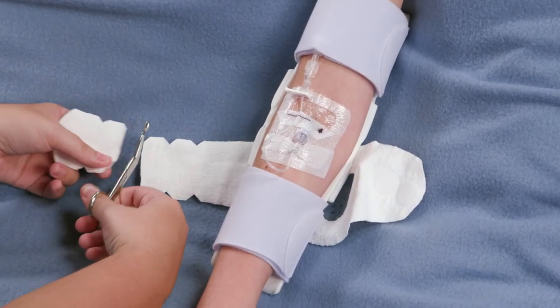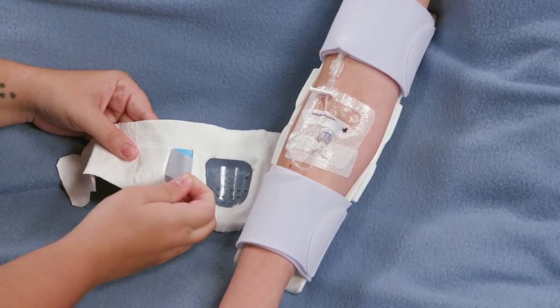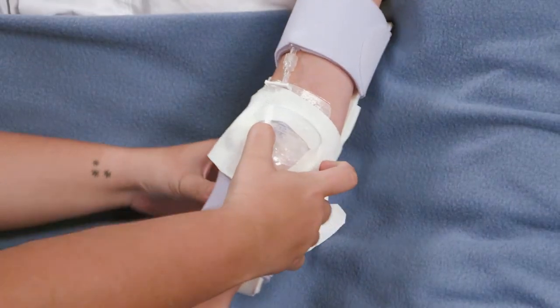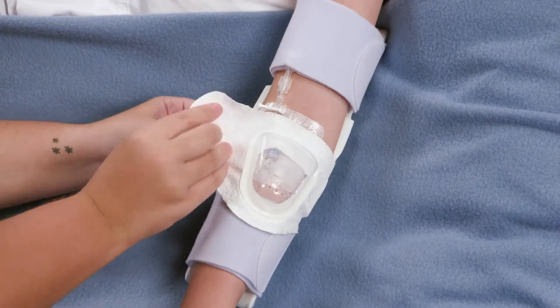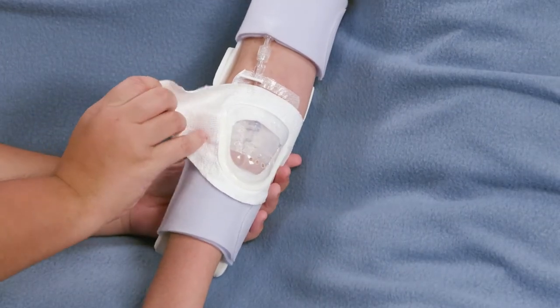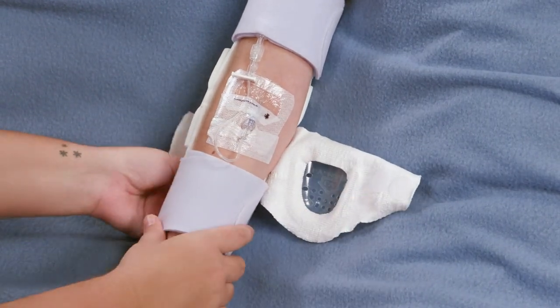Cut off excess fabric. Remove the blue release paper to expose a strip of soft surgical tape that keeps the device from sliding. Rewrap the fabric, gently pressing the tape into place. Close with Velcro. Inspect the IV site by releasing the Velcro tab, lifting the dome, and viewing the entire site.